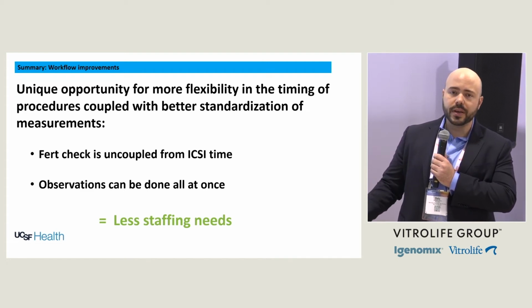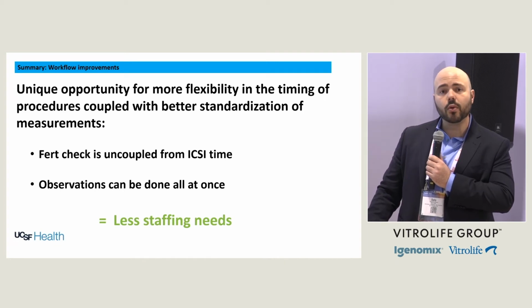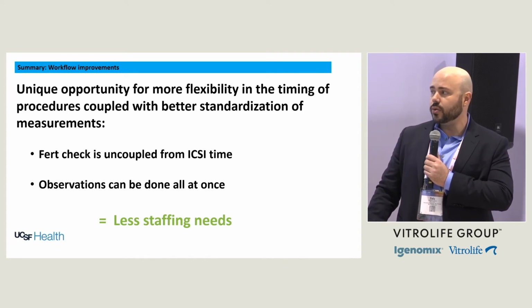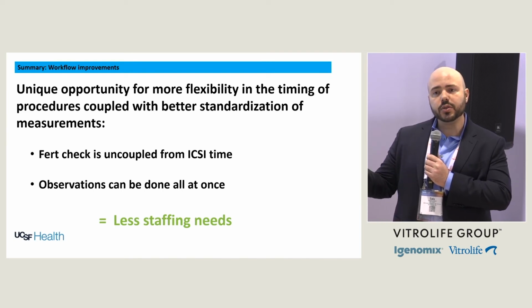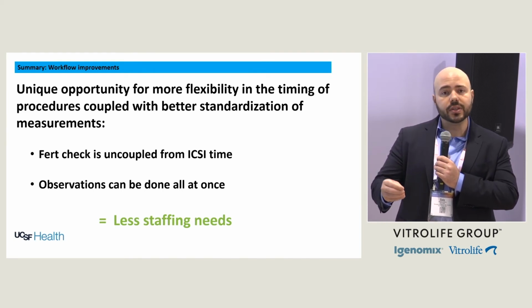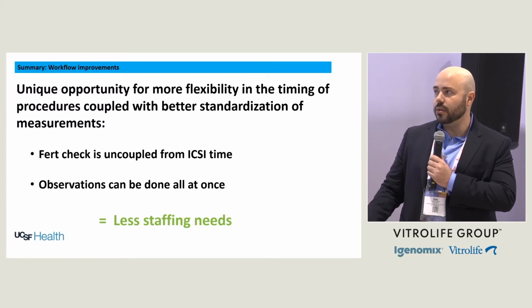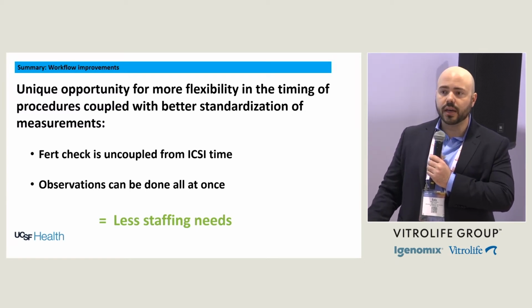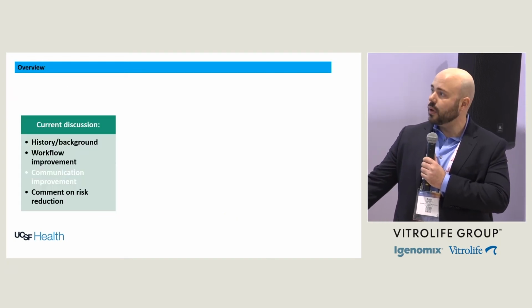As we all know, we're facing a difficult time now with the workforce in laboratories. And also it's not that we're not giving the time for an embryologist, but the embryologist might be doing other tasks within the lab that might be more important than just observing the embryos with the older method compared to the time-lapse system.